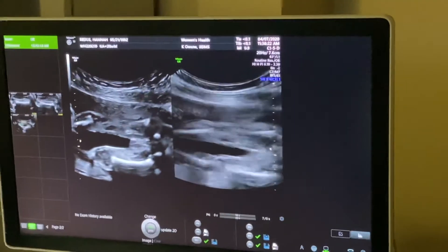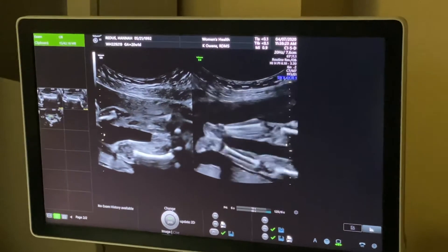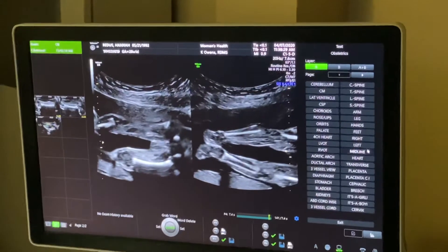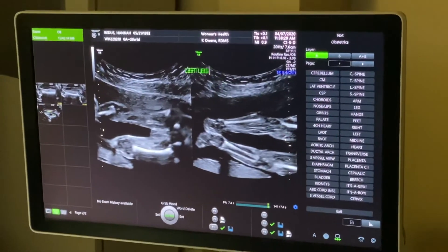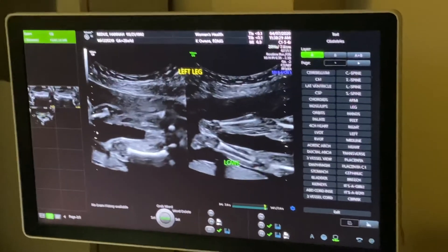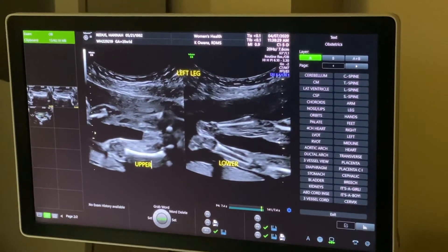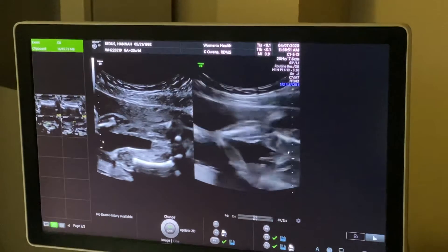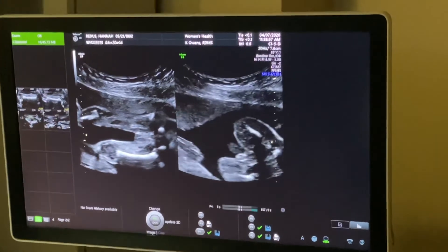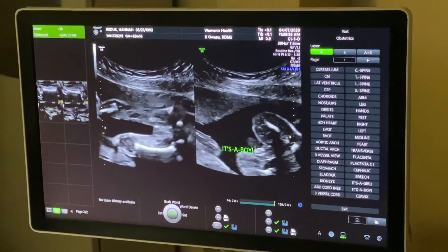This is an umbilical cord, so we'll get a better picture in a minute. There's his butt bones. I'm surprised he's being so still right now — he's never this still. So this is my leg, and this is my leg. There's his little pee-pee. Hiding in there.